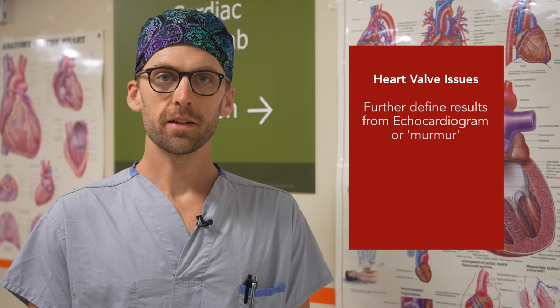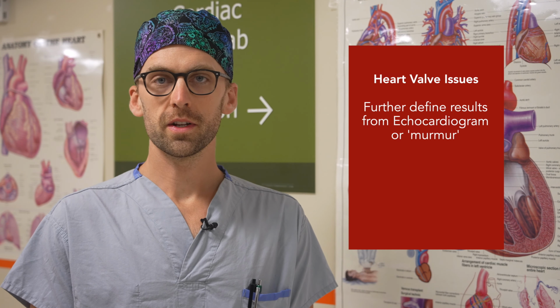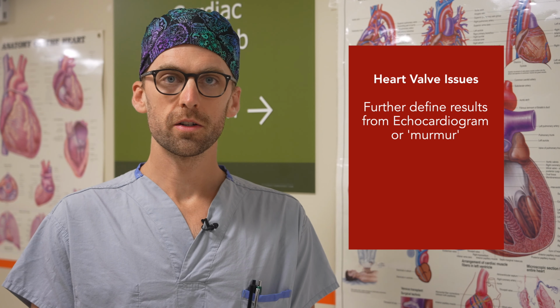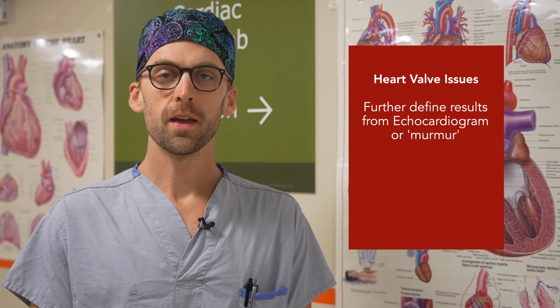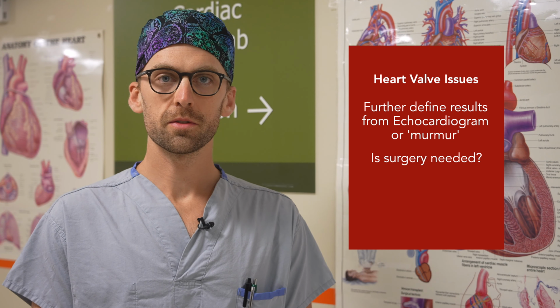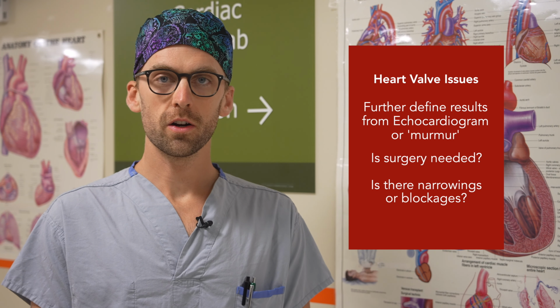There are many causes of heart failure, and an angiogram allows a cardiologist to determine if narrowings or blockages in the heart arteries have led to heart muscle damage, ultimately weakening the heart. Heart valve issues. Your doctor may suspect you have heart valve issues based on an echocardiogram, which is the ultrasound of your heart, or having heard a murmur when they listen to your heart.